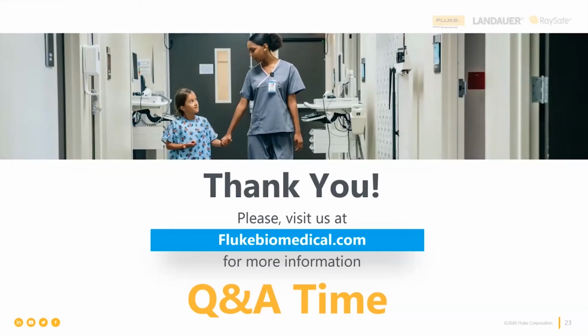There's a lot of environmental conditions, and the more we worked on them, the more we found out that we needed to test them more often because of those environmental conditions. You don't know, something can happen to it. And when you're using your defibrillators and AEDs, are you using them in a nice, calm, cool, collected manner where you have time to troubleshoot something? No, you're panicking. Think about the worst case scenario, and that's when it's going to be used. It's going to be used in a rainstorm. It's going to be used when there's somebody dying in front of you and you're panicked. You have too many other things going on to try to remember to troubleshoot through those things.